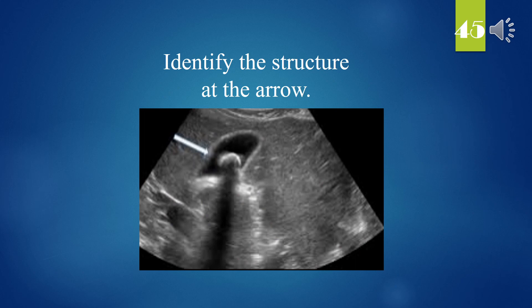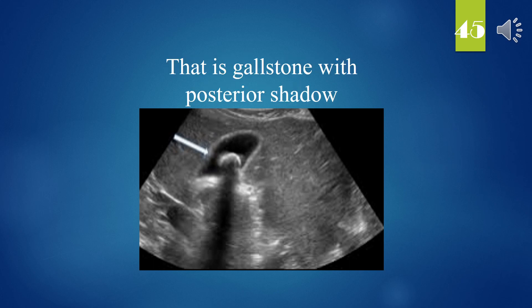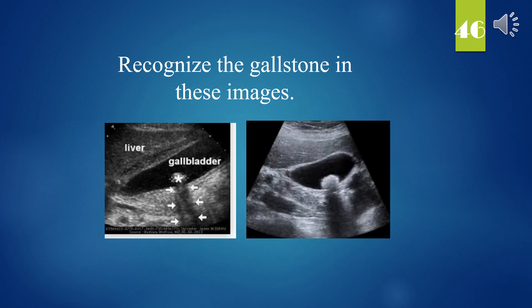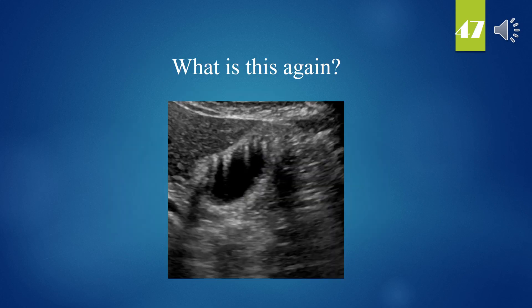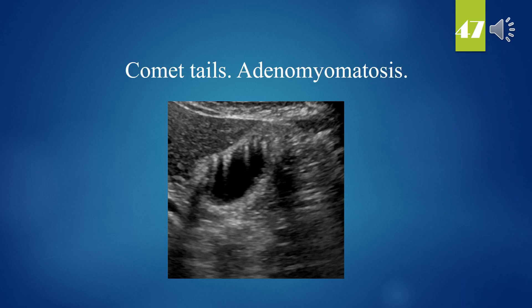Identify the structure at the arrow. That is a gallstone with posterior shadow. Recognize and memorize the gallstone in these images. What is this again? Comet tails — adenomyomatosis.